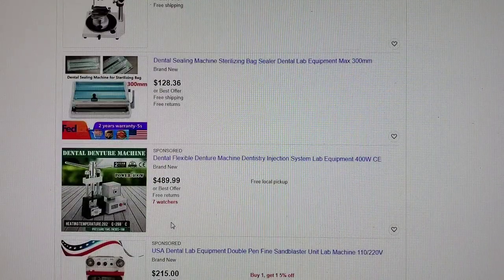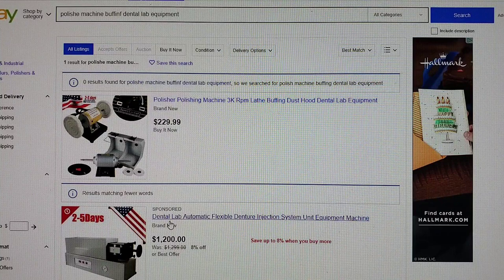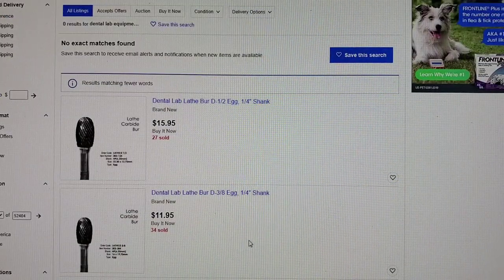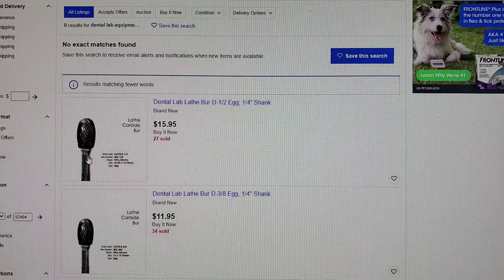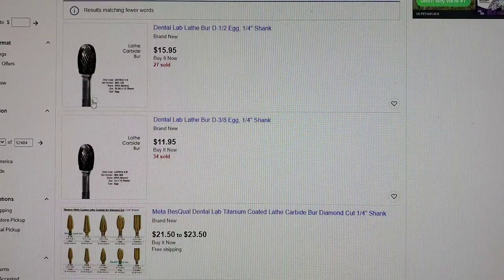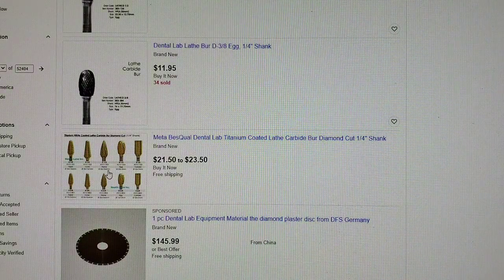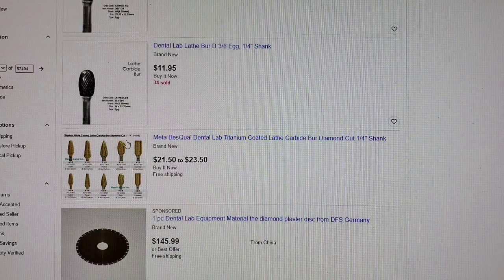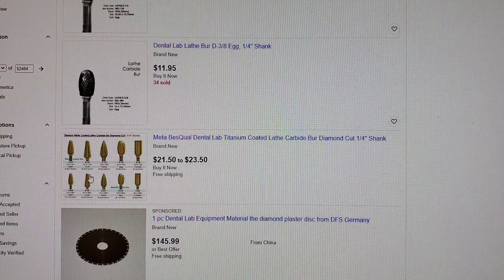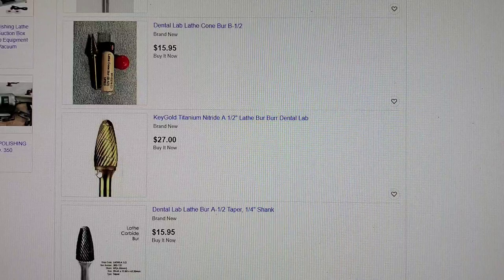Now I'll show you some burrs you'll need to polish your denture. It's important to polish really well. There's a lathe burr here with an egg shape — it's good to have one or two in your toolbox. You can buy this set, though I don't use it that much. You can buy a set based on your own preference, and those are also good to have in your toolbox.